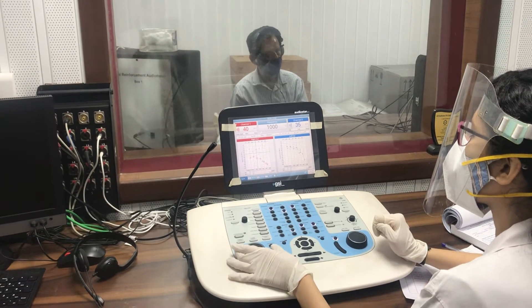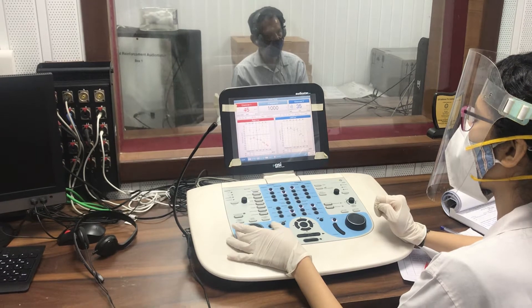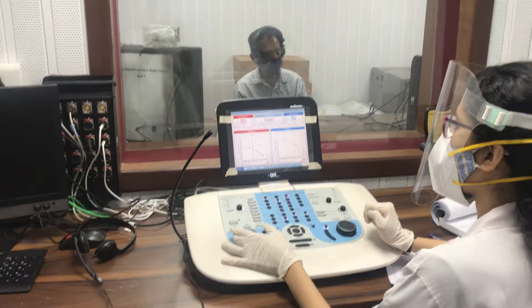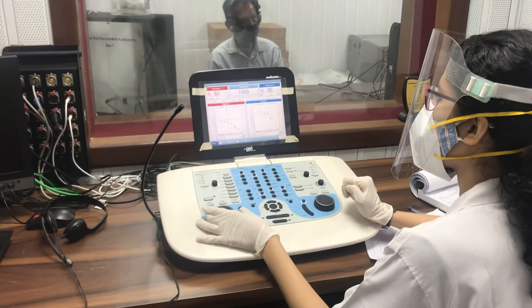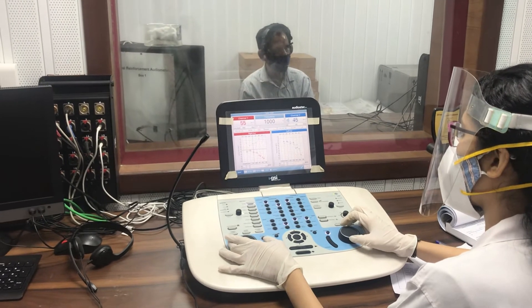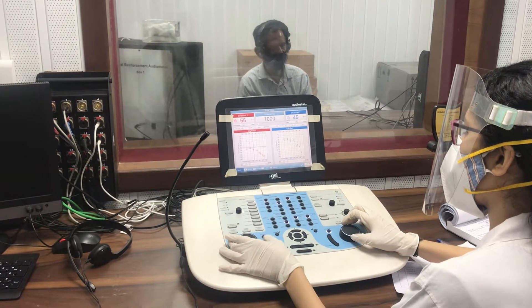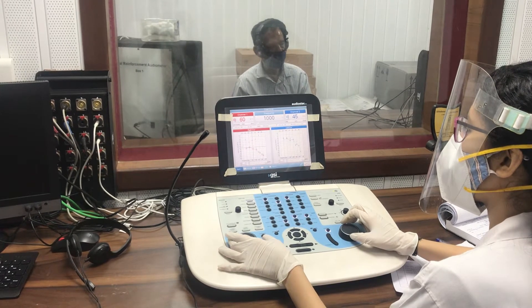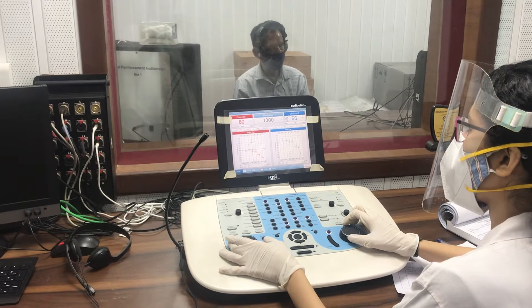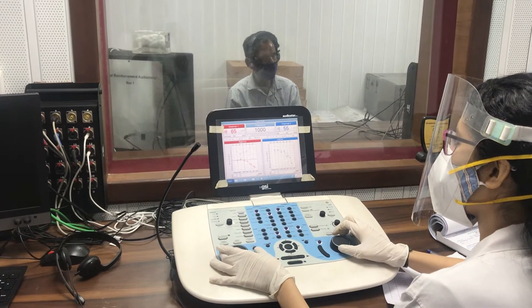You would introduce the noise to the headphones, and from channel 1 you will be presenting the BC signal. The instruction for BC masking would be that the patient has to listen to the tone which is presented through the BC vibrator.